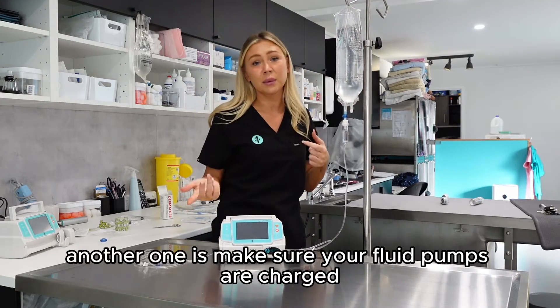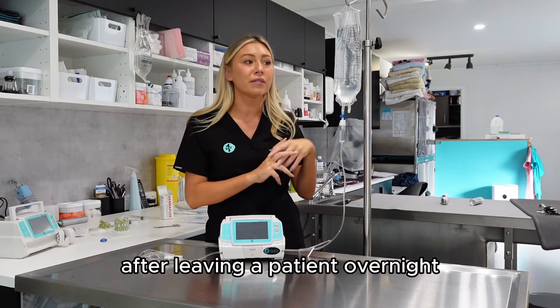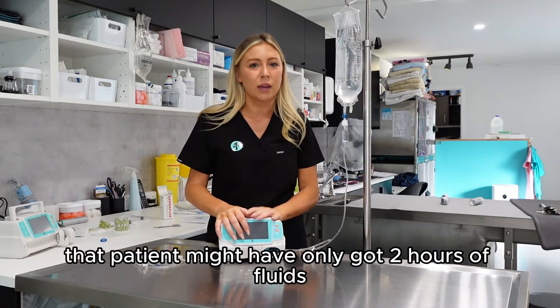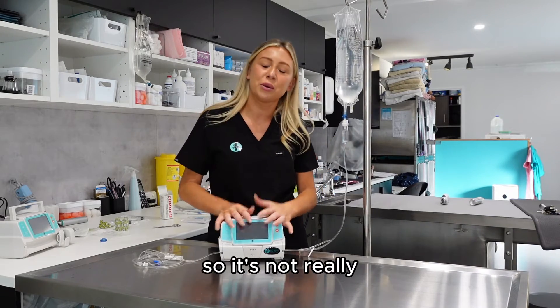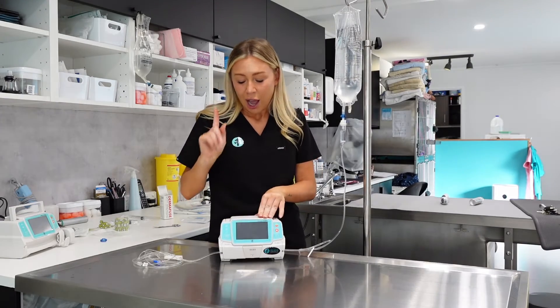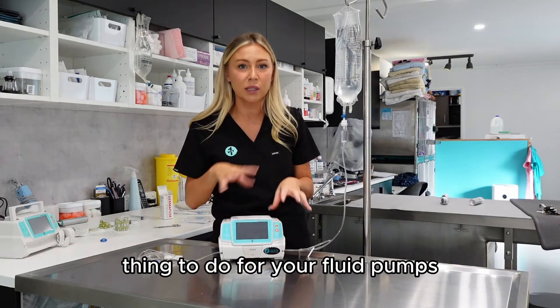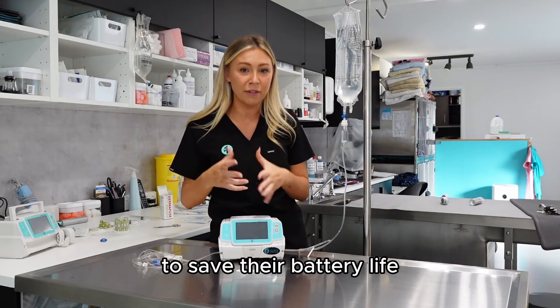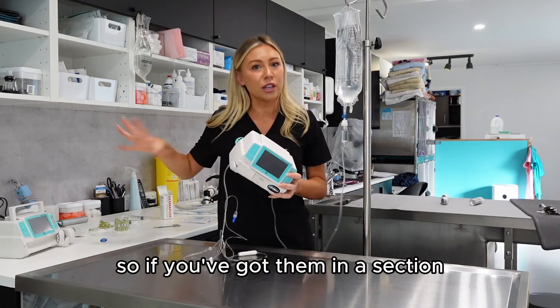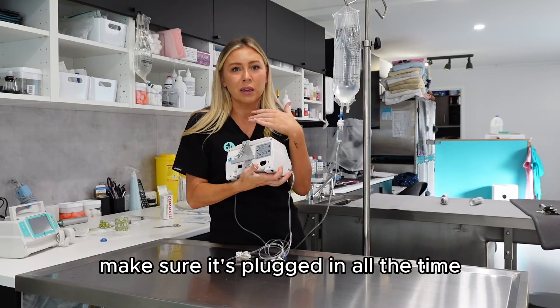Make sure your fluid pumps are always charged. It's common to come in the next morning and find the pump has died overnight, meaning the patient may have only received two hours of fluids, which defeats the purpose. A good tip to extend the life of your pumps is to always keep them plugged into power — if you have them in your treatment area or surgery room with access to power, keep them plugged in all the time.